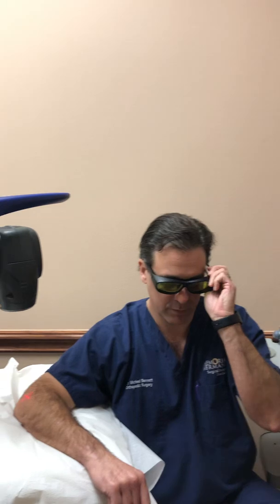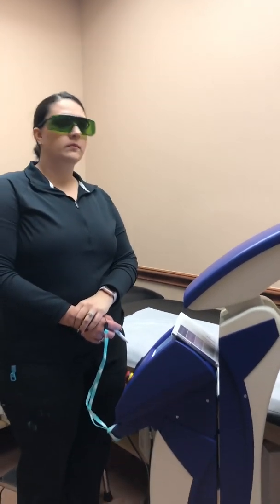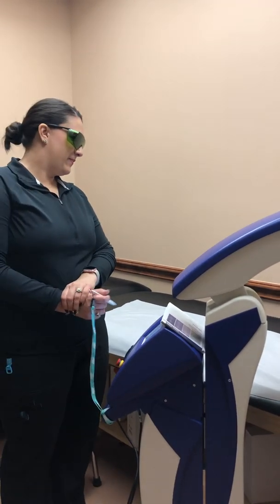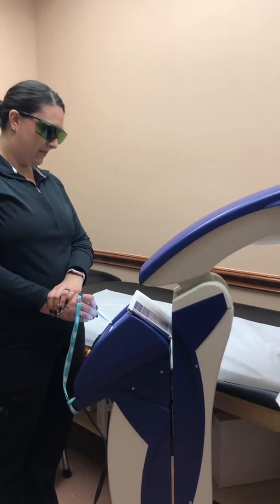Right now we're about to start this. I'm going to go ahead and put on my safety goggles, because you always want to make sure you protect your eyes. Once it's mapped out the body part, I have my assistant here, Ricky, who's going to turn the laser on — and I'm about to be zapped. So go ahead and start that.